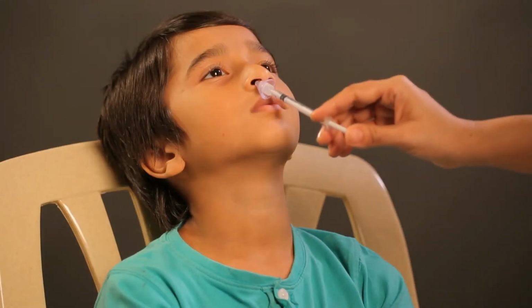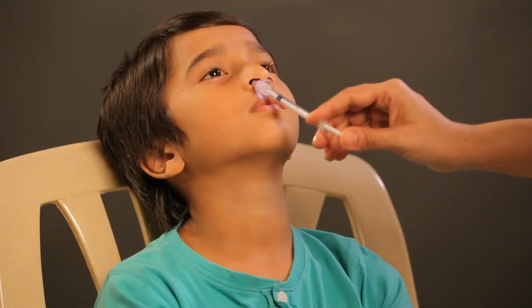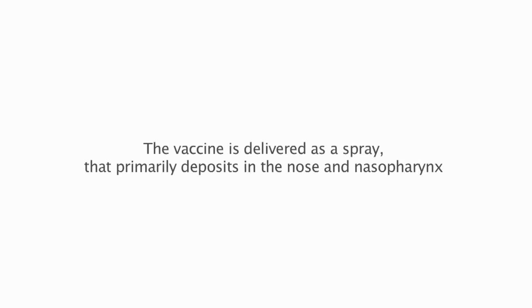Repeat the above step to deliver the remaining 0.25 ml into the second nostril. Let the recipient remain with the head tilted back for about 30 seconds. This completes the administration of the entire dose. The vaccine is delivered as a spray that primarily deposits in the nose and nasopharynx.